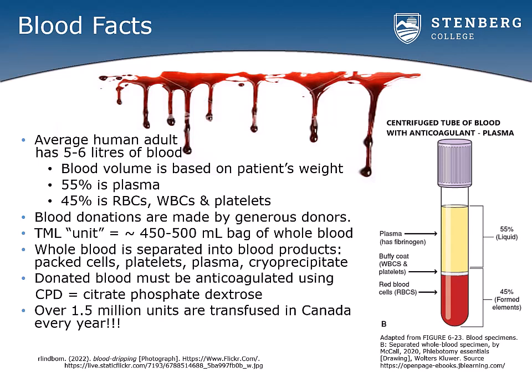Blood donations used in transfusions are made by very generous donors every day. In TML, a unit of blood is a common term for a 450 to 500 ml bag of whole blood. Once the blood is collected in a blood donation center, it's sent off to be tested for blood type A, B, AB, and O, and also for infectious diseases that could be transmitted, like HIV and hepatitis.